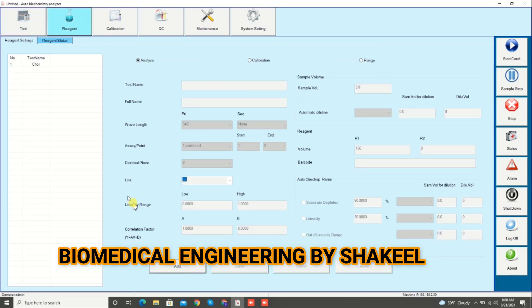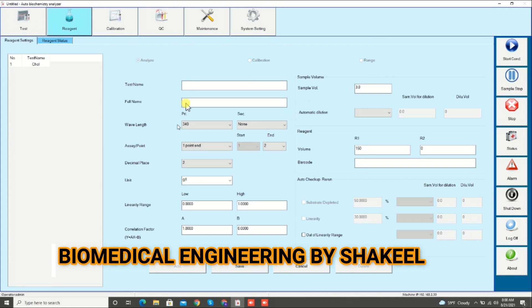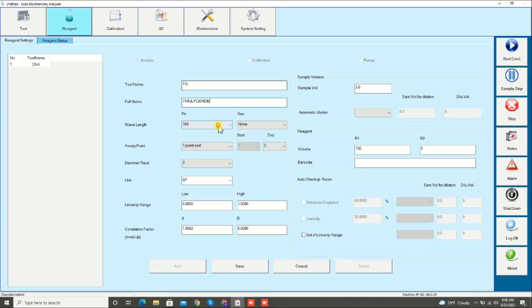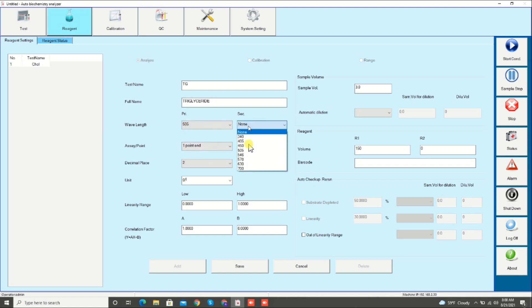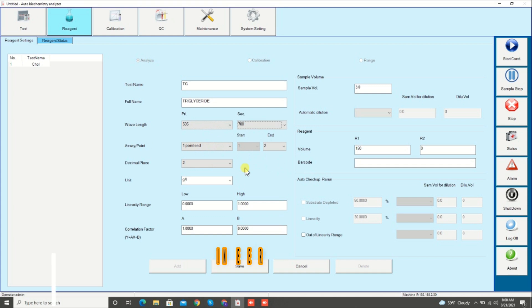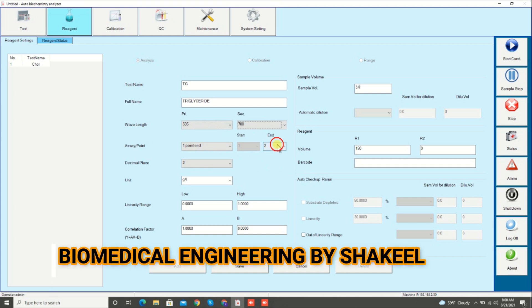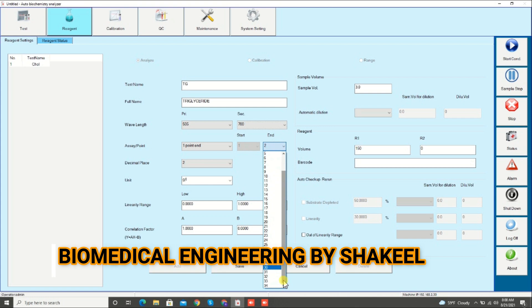Now we will see how to do the configuration of parameters. For example, if you want to add any reagent, click on add and enter the name of the test. For example, I'm going to write TG — triglyceride — enter the full name, then enter the wavelength. The wavelength of triglyceride is 505 and the second wavelength is 700.